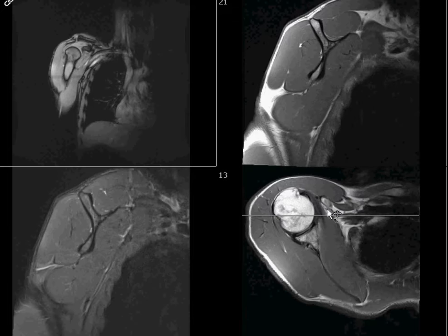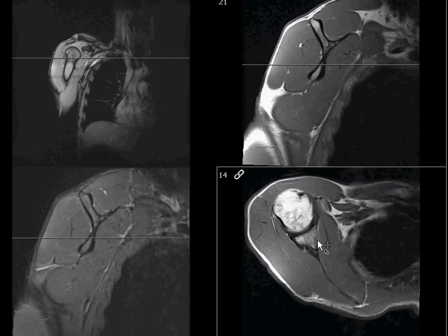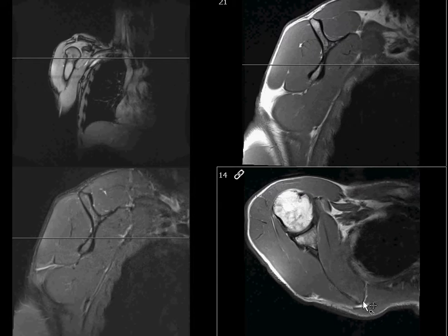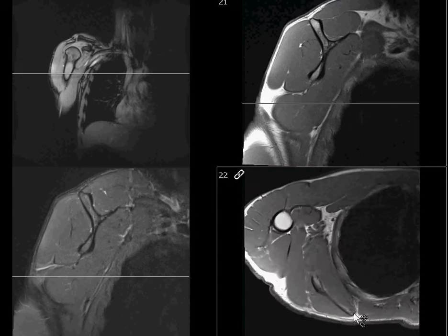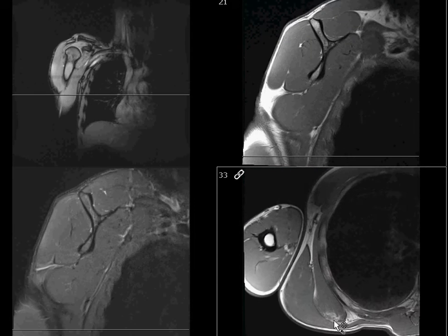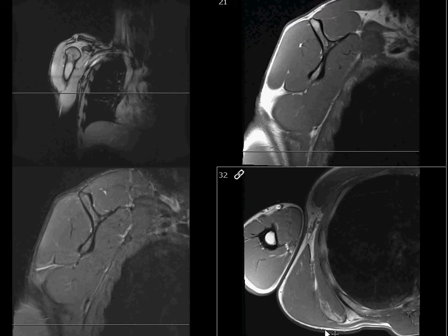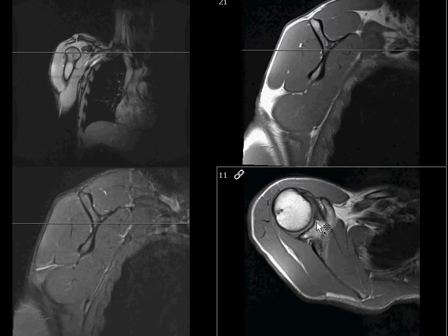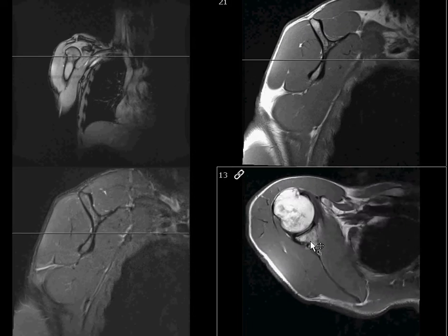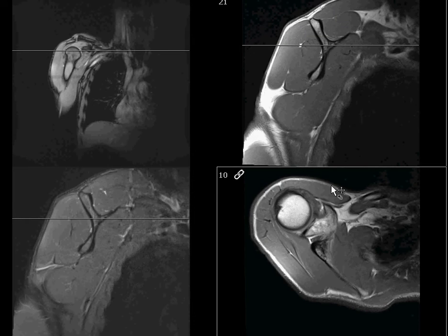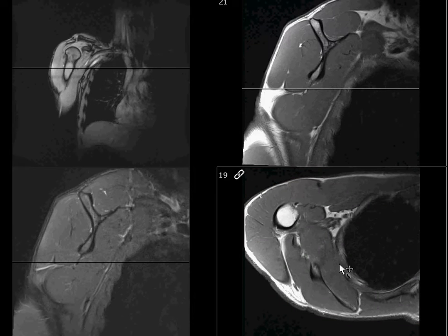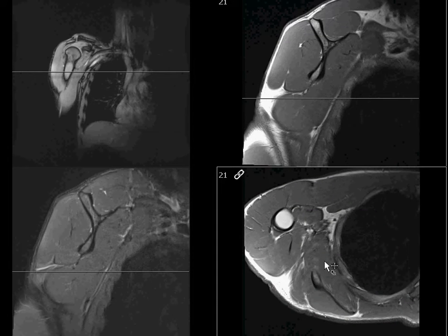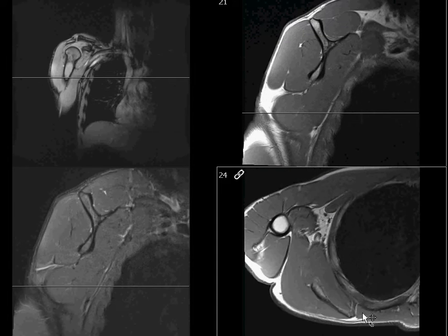You can see when you get axial images here on this T1, the scapula goes all the way out to here and then all the way down to here. So this is the inferior angle of the scapula and the medial margin of the scapula all the way to the glenoid surface. We want to cover all that, and in addition, what people are typically looking for are the findings between the scapula and the chest wall.